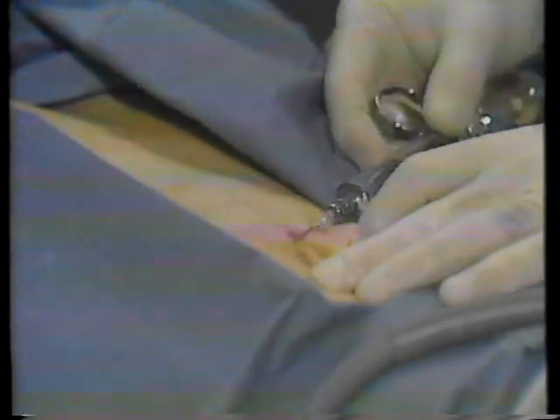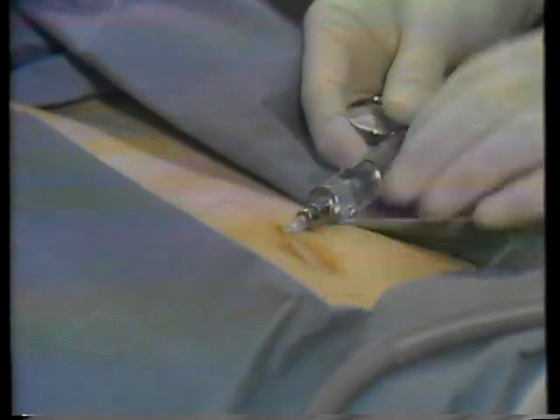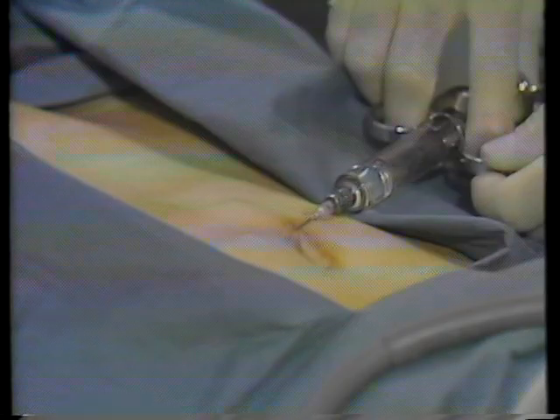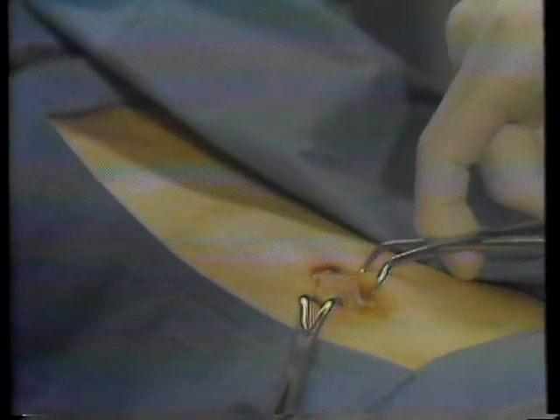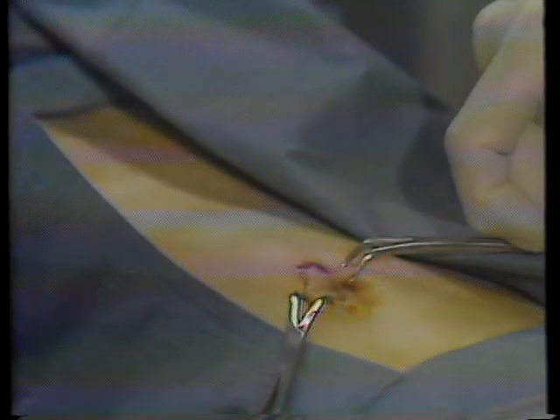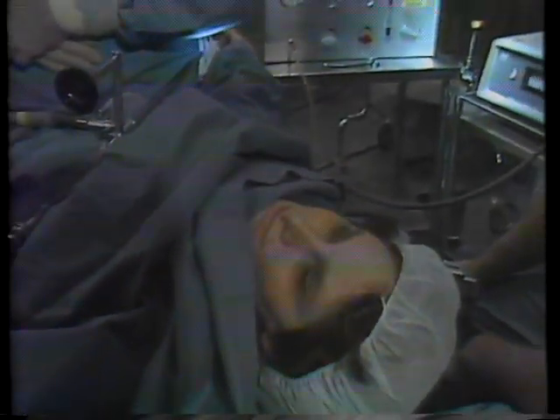If you have chosen to have local anesthesia, you will feel a needle as the anesthetic is injected. This will numb the skin so you do not feel discomfort as the rest of the procedure is performed. You can see this patient is able to talk to her doctor and does not feel any discomfort.